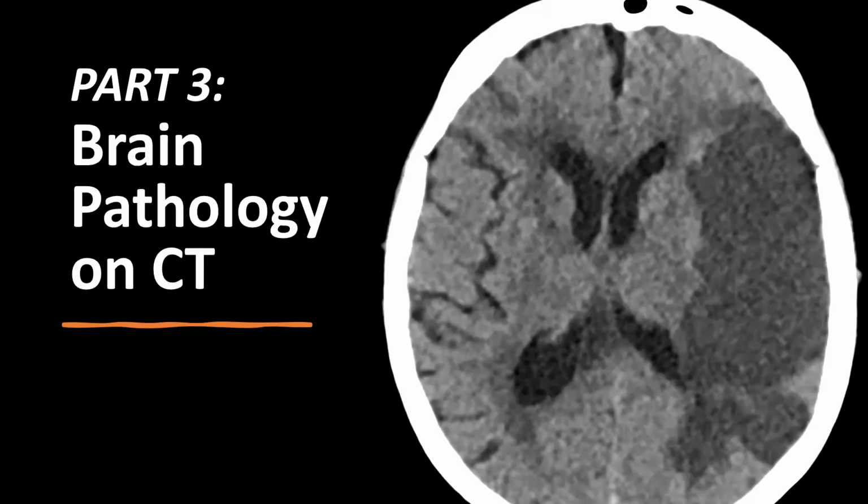Hello and welcome in this final video on how to read a brain CT. In the first two videos we talked about the basic principles of CT, how a CT image is generated, and the basics of CT interpretation. In the second video I talked about brain anatomy on CT, and now finally we can talk about brain pathology.